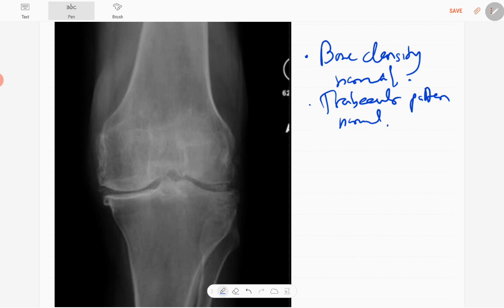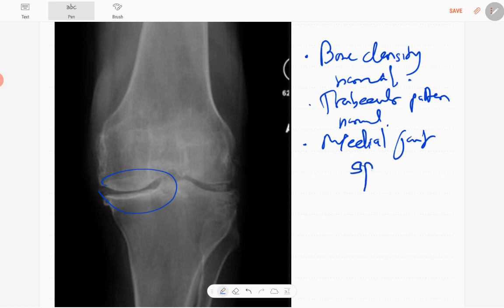However, there is reduction in medial joint space in the knee. The medial joint space is reduced and you can see some calcifications.